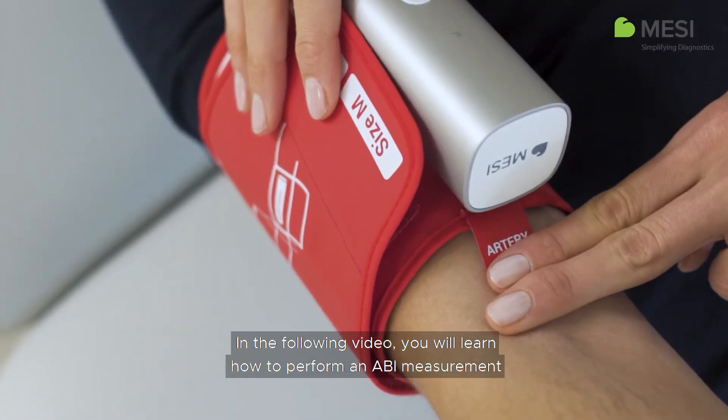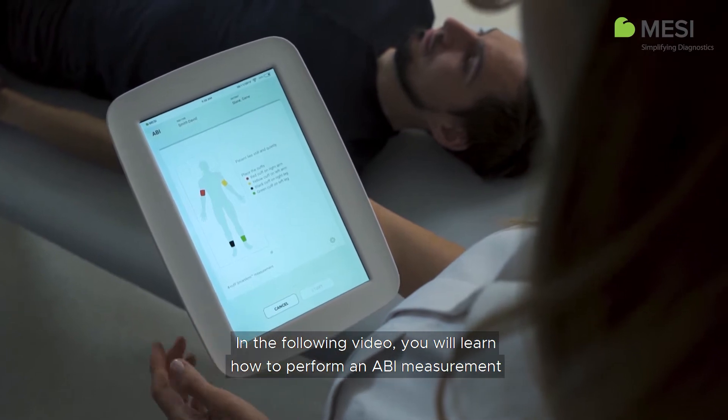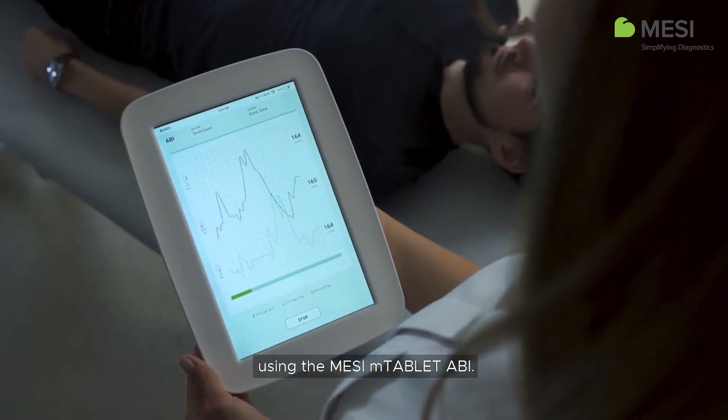In the following video, you will learn how to perform an ABI measurement using the MESI mTABLET ABI.